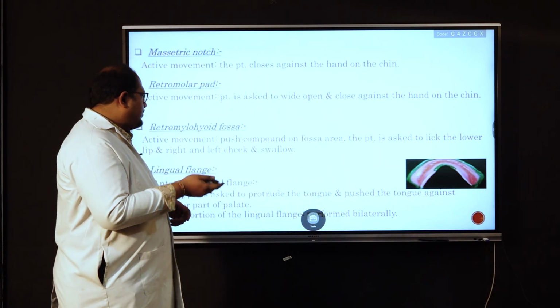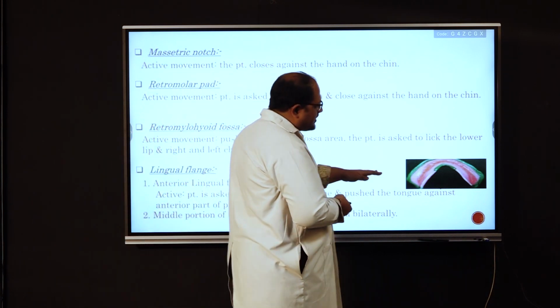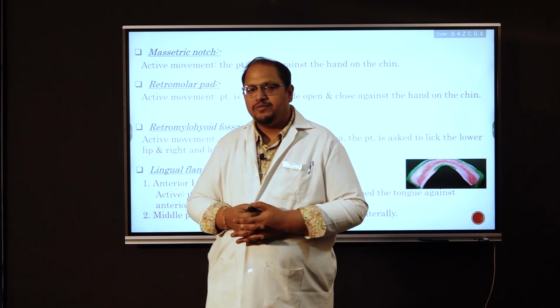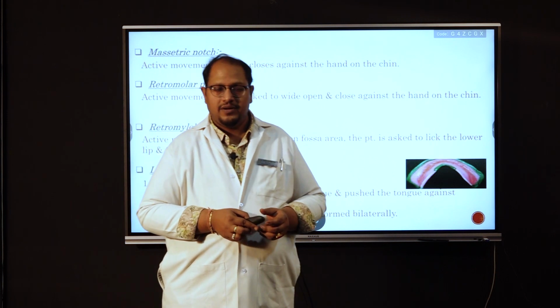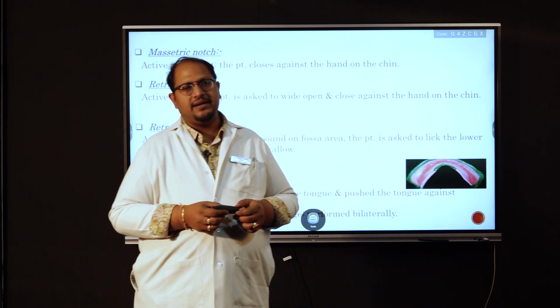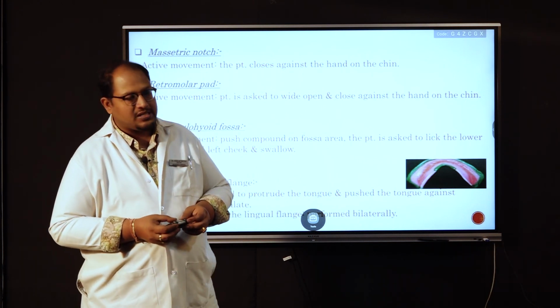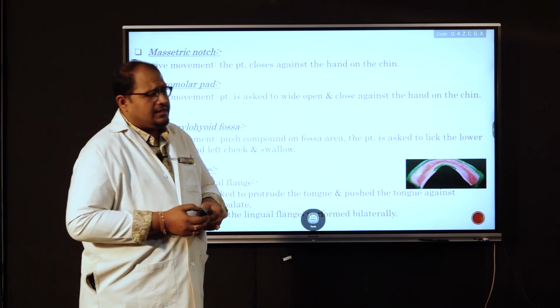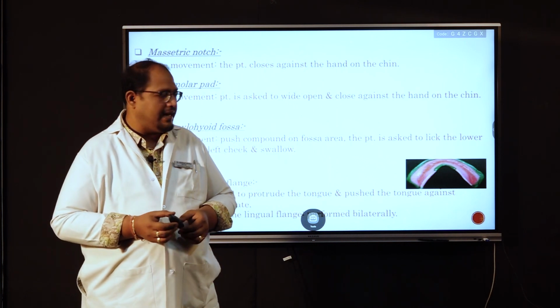After the buccal side is totally finished, now we will start with the lingual side for recording the denture. Now when we have to start the border molding for the lingual side, we need to divide it into 3 different parts, right? The first anterior section is called the lingual crescent area, then we have the mylohyoid ridge area, and then we have the post mylohyoid region, which is also known as the lateral throat form area for the mandible anatomic landmarks, correct?